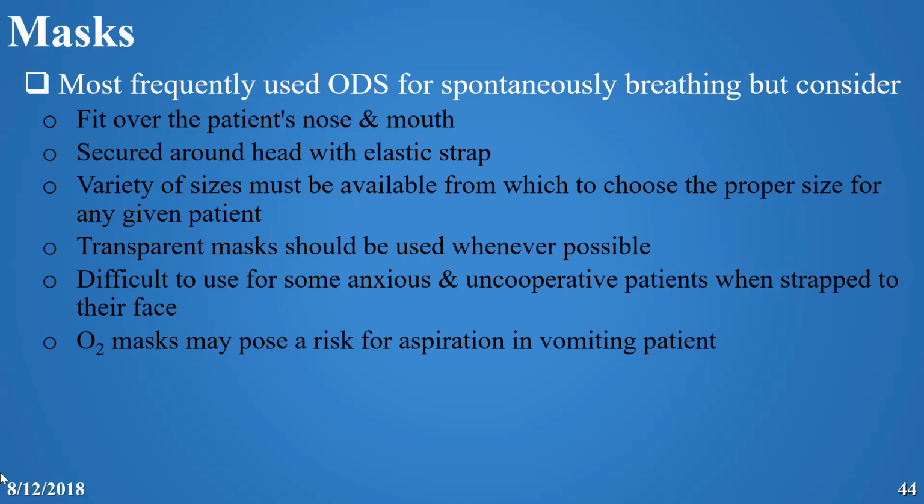There are various sizes, and we have to choose the size by putting one edge of the cushion of the mask at the tip of the chin, and then roll it over the mouth and the nose until the other end reaches the bridge of the nose. So that's how we measure the size of the mask.